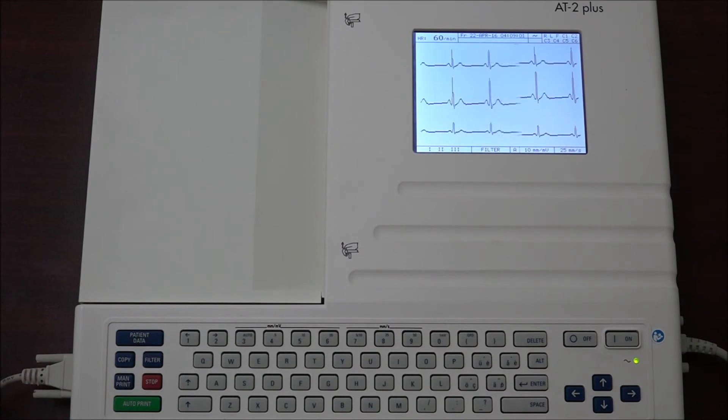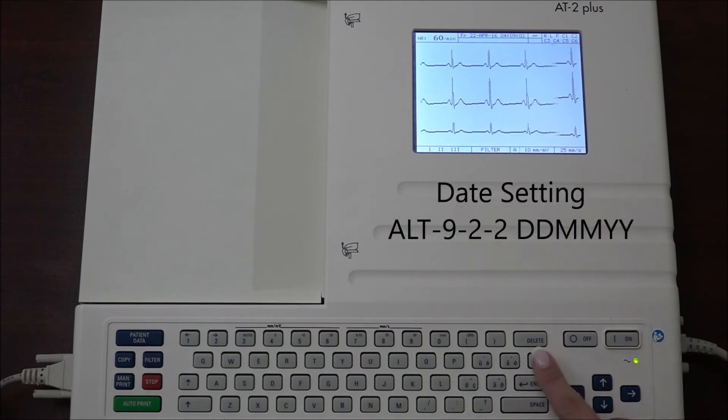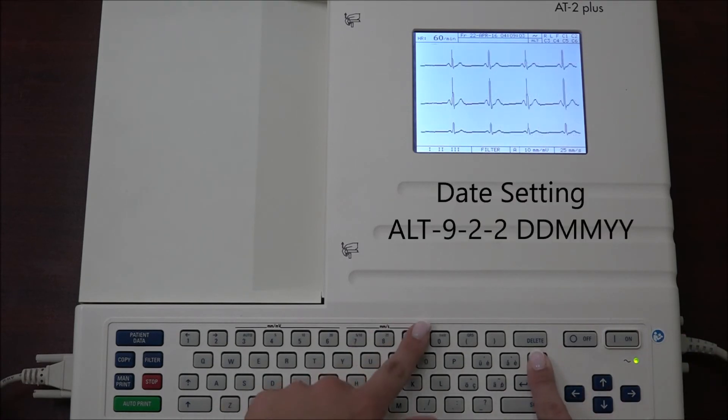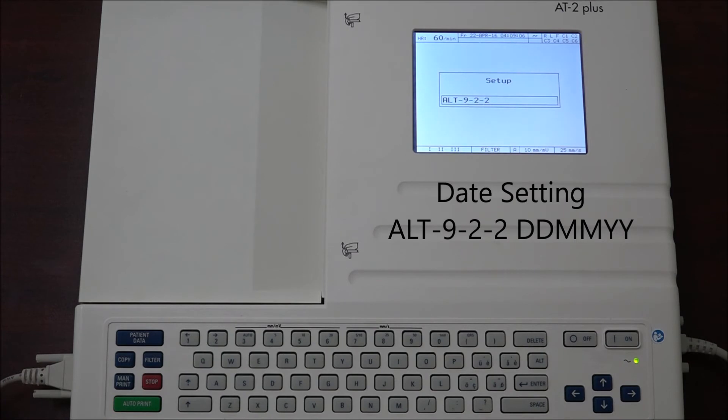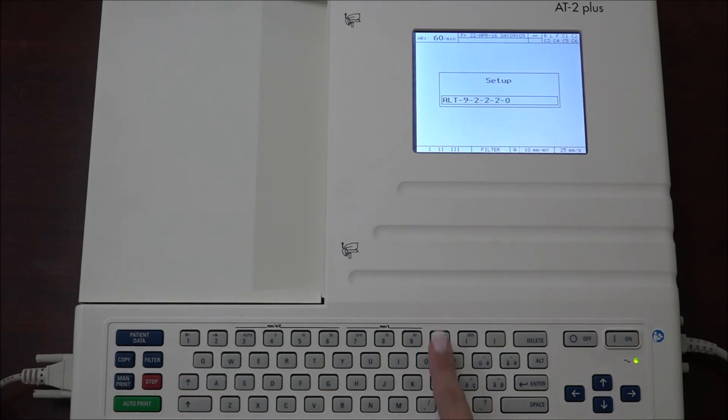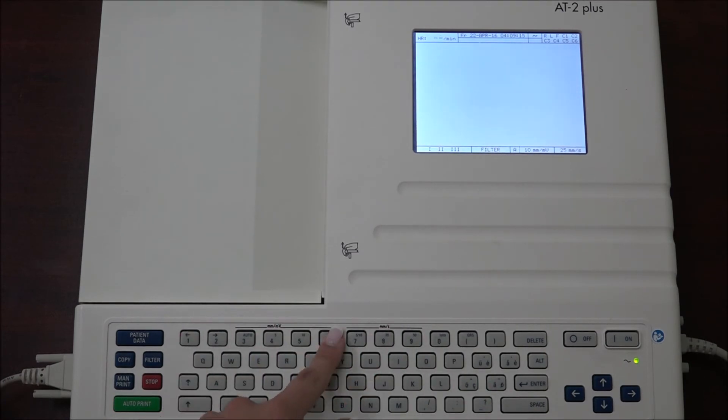To set the date, press ALT 9 2 2 and enter the day followed by the month and ending with the last two numbers of the year. You will hear a confirmation beep.